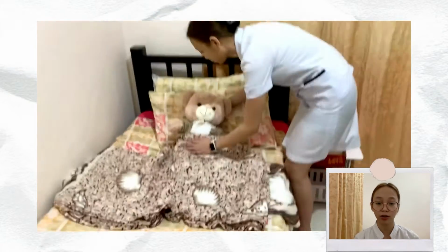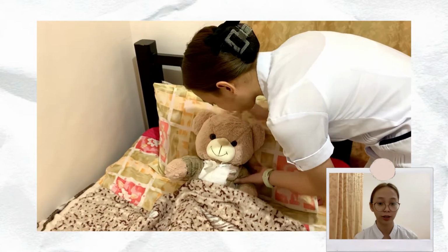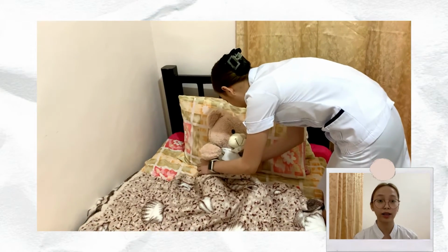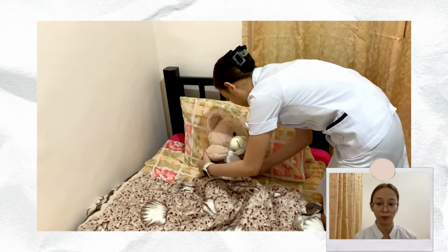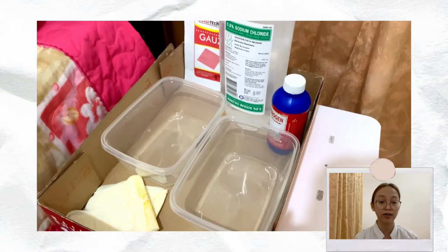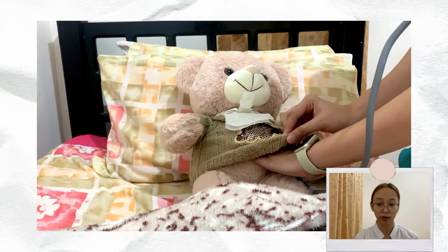If the patient is conscious, place him or her in a semi-Fowler's position. If the patient is unconscious, place him or her in a lateral position facing you. Move the overbed table close to your work area and raise to waist height. Number 8, check for lung sounds.